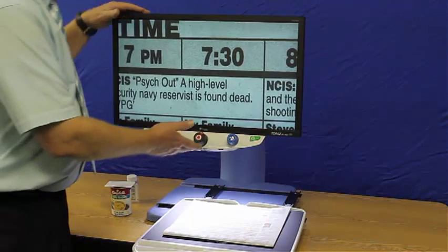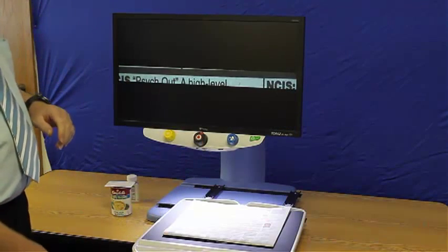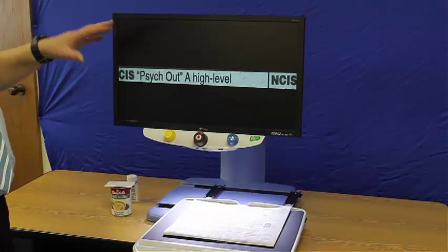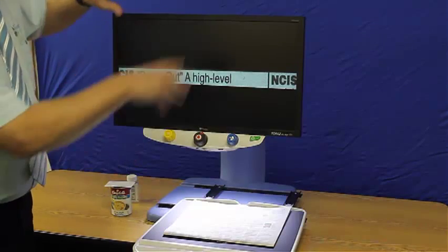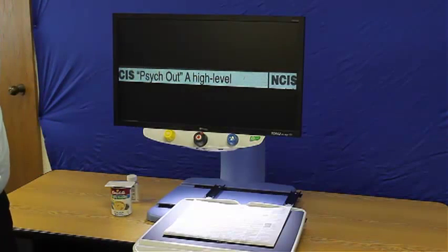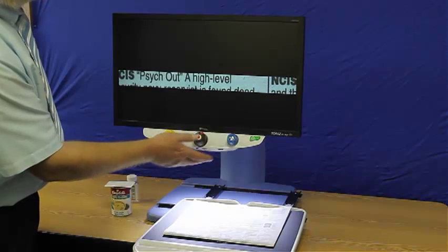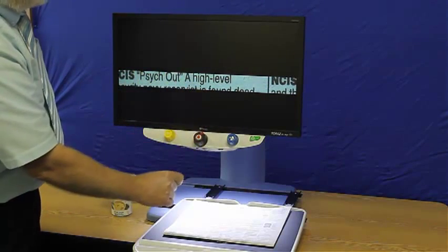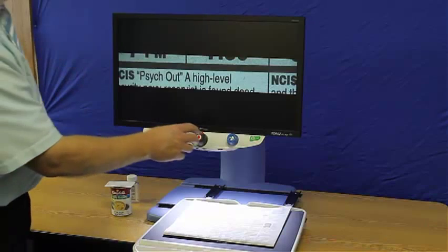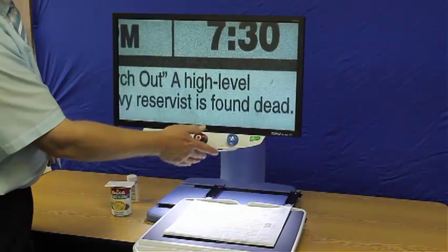There are also controls underneath this panel, and what that allows us to do is what we call shades. If you're doing a lot of, we'll say like the phone book, you looked up a name, there's a lot of different names there, a lot of different numbers. By hiding everything but that one line, it can make it easier for us to stay concentrated on what we're looking at. That can be moved up or down, so you can put it clear up here if you want, or down lower. You can also make that as big or as small as you want. If you want 2 lines, or if the print is bigger, you need that space bigger. Push it again, we're off.